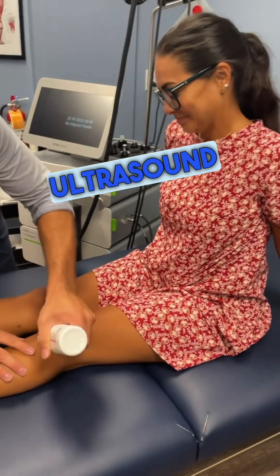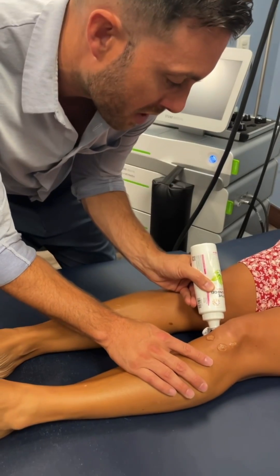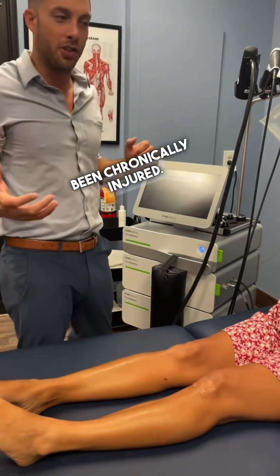We're going to do a little bit of focused ultrasound here. This helps if you have ligament adhesions, muscle injuries, areas of arthritis, or areas where your body's been chronically injured.